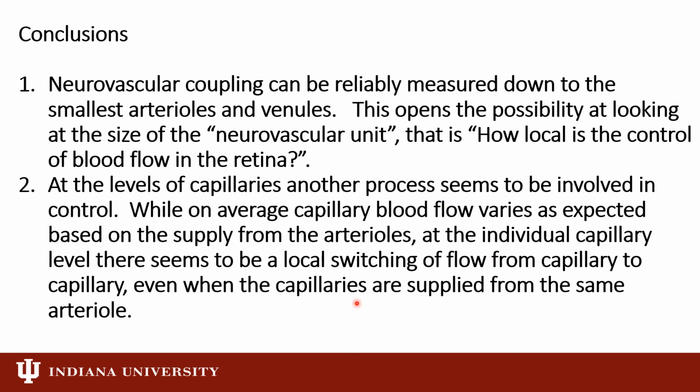And so while on average they do show the impact of neurovascular coupling, there's an additional source of variability where the capillaries seem to be switching through various levels of flow independent of the local demand as applied by us. That may be responding to local demand in terms of local signaling from the retina, but it's at a local level. And so that's our talk.